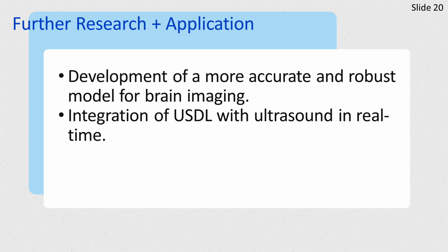Currently, our model is a proof of concept for a method to image the brain. Our model simulates cranial ultrasound scans by artificially adding 90% speckle noise to our training dataset. We plan to acquire an extensive set of cranial images to train our model and improve USDL.